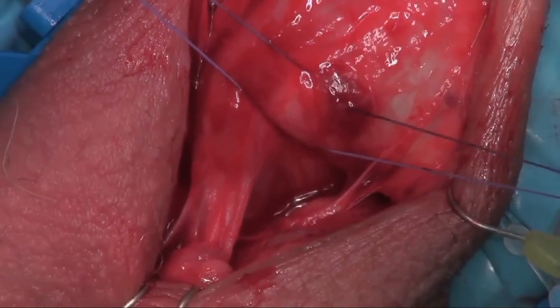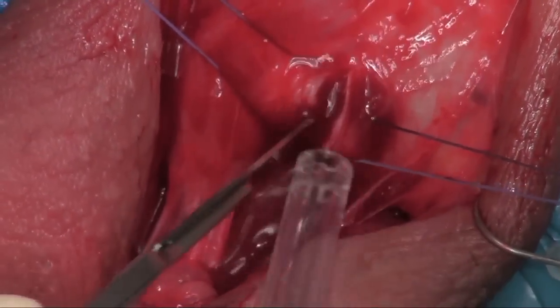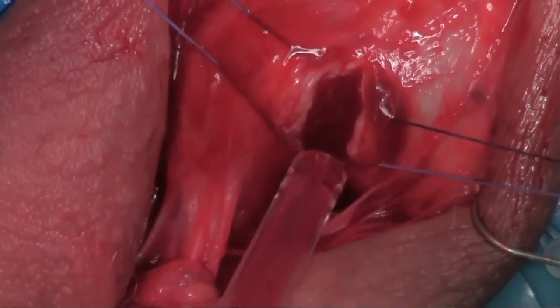Here I'm making the corporotomy. Start at the distal incision, go past the proximal incision — needs to be about a centimeter and a half in size.